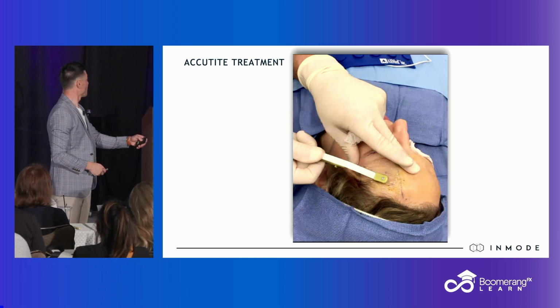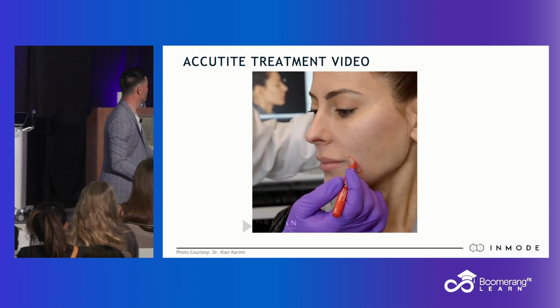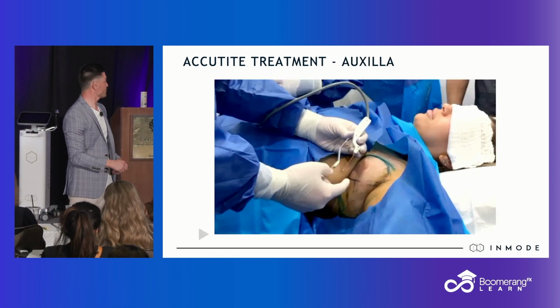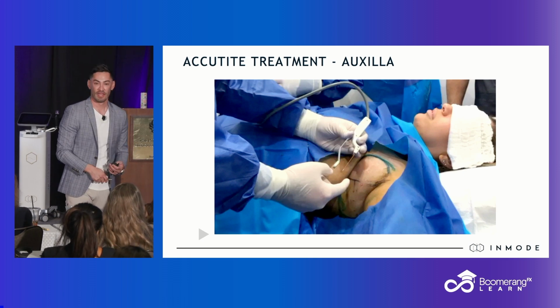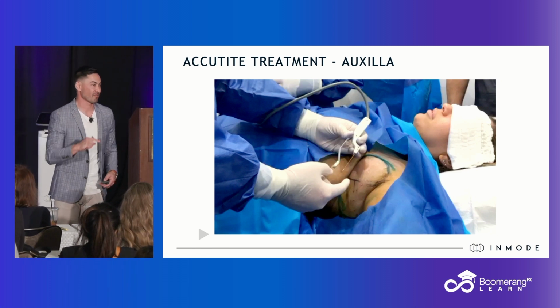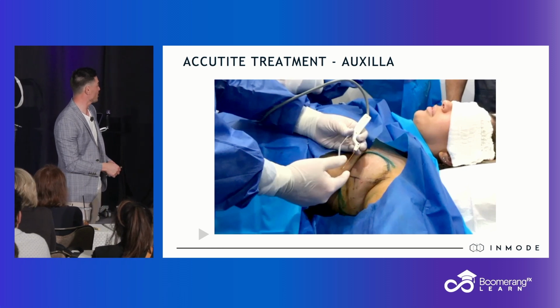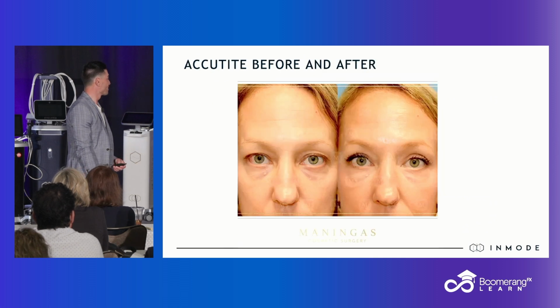So, and then jowl. Today we're going to be doing an innovative... This is evidence of just because you could doesn't mean you should. Do you see the size of this AccuTite? Look at the size of this roll. I would use a BodyTite so I can quickly and efficiently heat this up. Dr. Spiro, by the time 24 hours later that he's finally to tissue temp, I will have long been home, drinking my favorite drink, sitting on my couch watching TV. So just because you could doesn't mean you should. There might be a better tool in the toolbox for you. Yes, you can use the AccuTite, but you might have better opportunities.